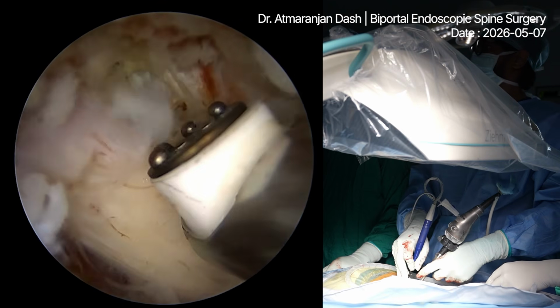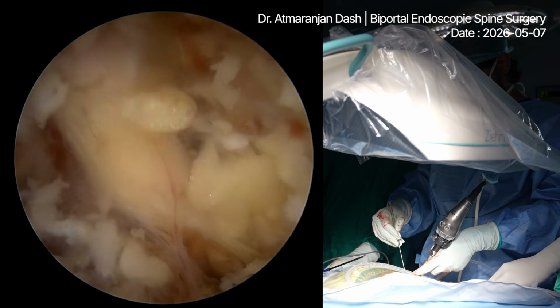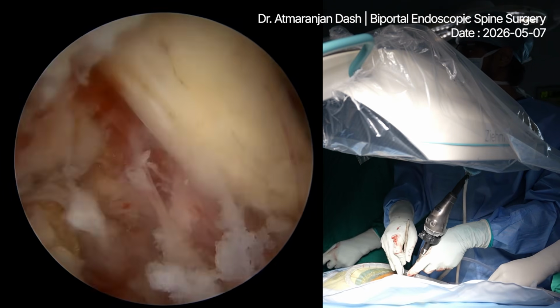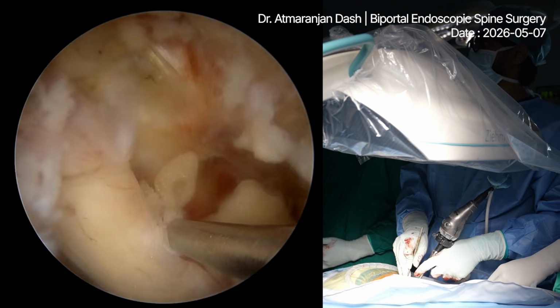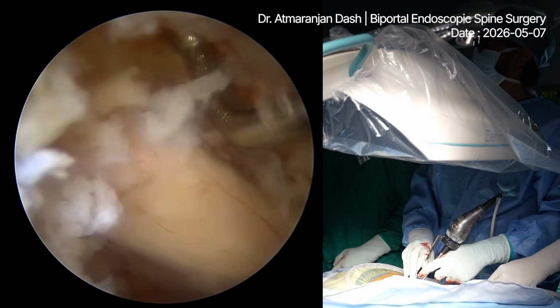Check. Okay. Yes, sir. And here also sometimes you should see, because this is also better. Root is also mobile. You see, saline. Root is also mobile, and you can enter the foramen well. A little more of the curette is needed.